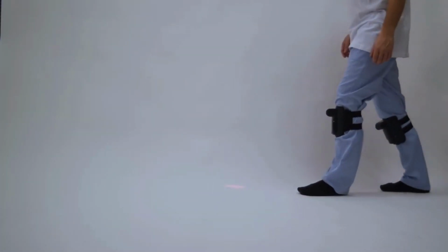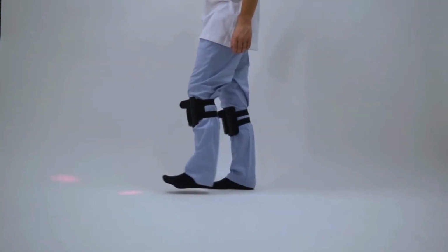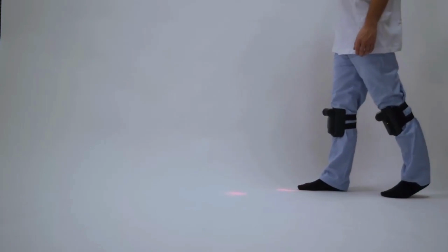Slow walking. In this exercise, the patient is required to walk at a slower pace than their standard. Visual feedback helps to maintain the pace, the stride length indicated by the physiotherapist, and the accuracy of the movement.